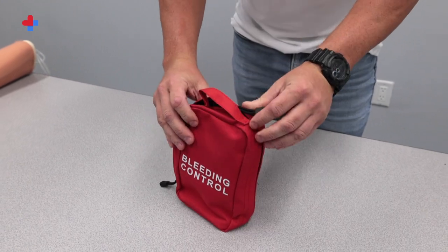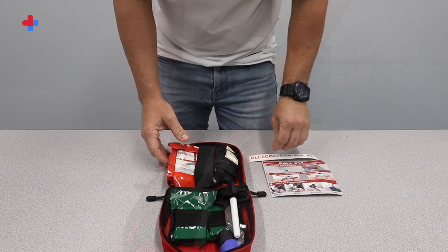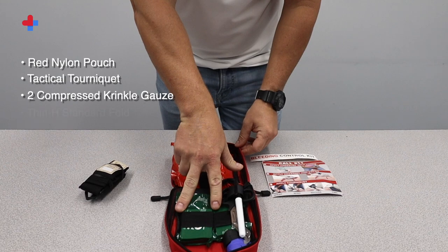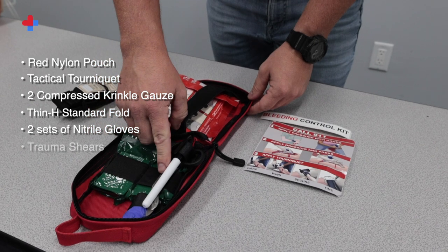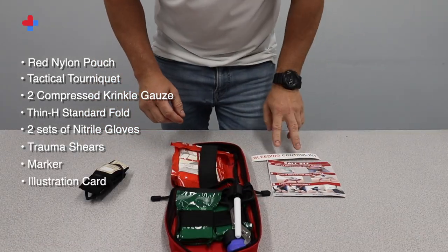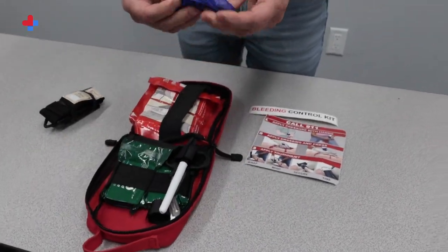Each individual USA Hockey Bleeding Control Kit includes one red nylon pouch, one tactical tourniquet, two compressed crinkle gauze, one thin H standard fold, two sets of nitrile gloves, one pair of trauma shears, one marker, one illustration card, and one bleeding control kit label.